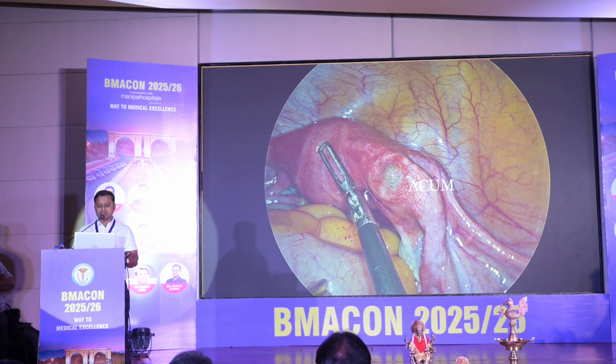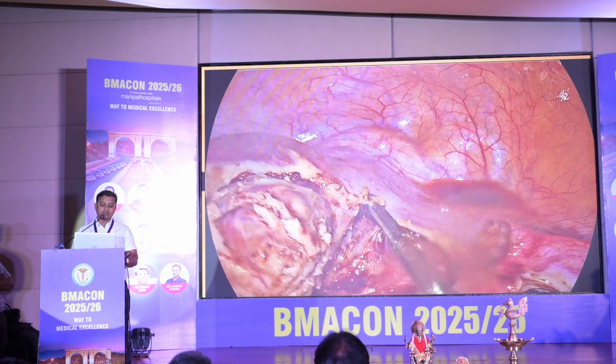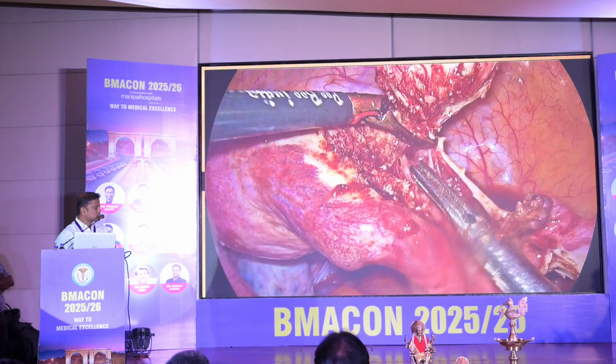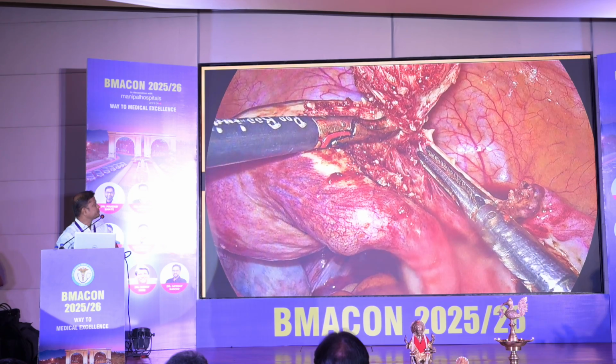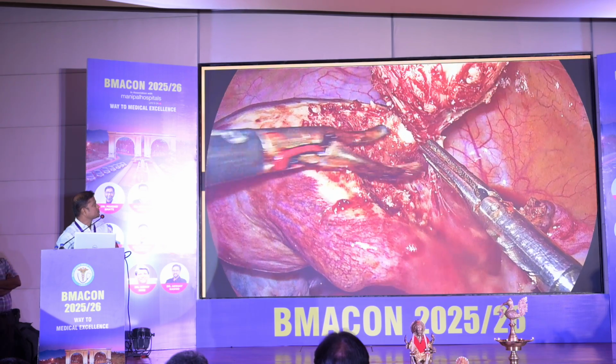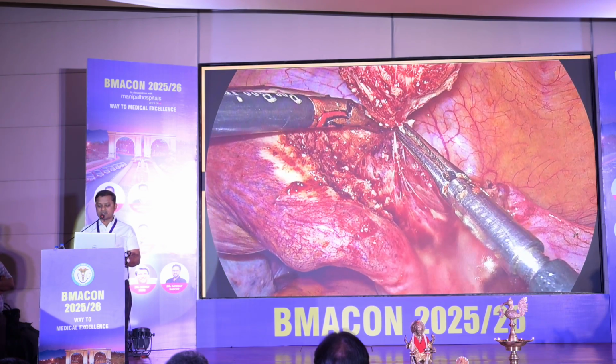At the same setting, she was corrected of this anomaly, and this is the ACUM we removed. Later on, the rough surface was sutured.